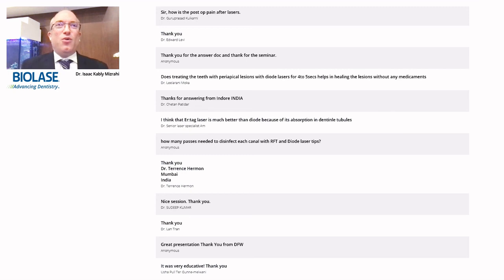Not at a speed of 2 millimeters, just to say. But what will help is not the time of exposure alone, it's a combination of time of exposure and obviously the wavelength you're using, because we have many types of diode lasers. I'm sticking to the 940 nanometers because it's the way that works best for me. But I wouldn't go for that time thing. I will say 940 nanometers works for a patient with a lesion, but it's technique sensitive, okay?